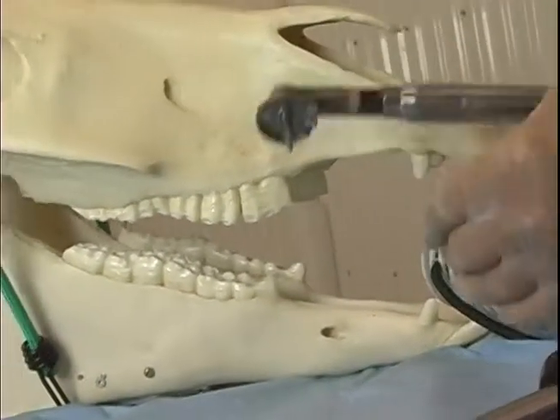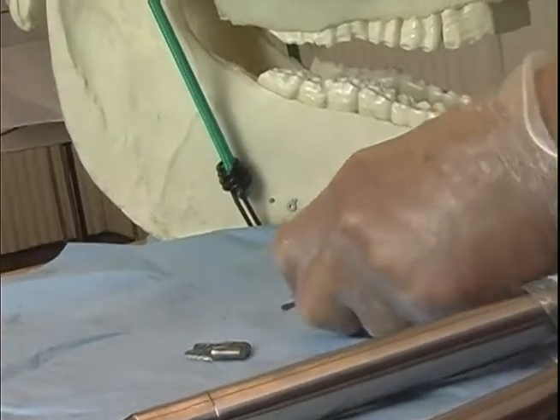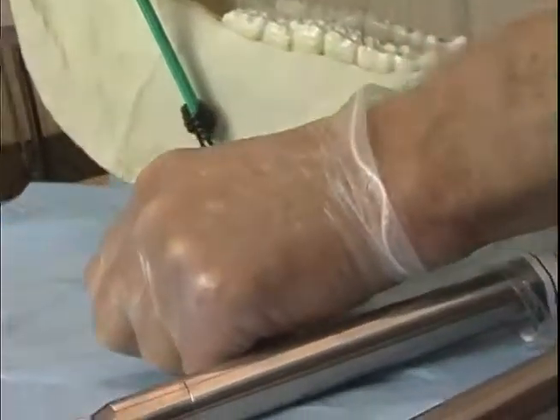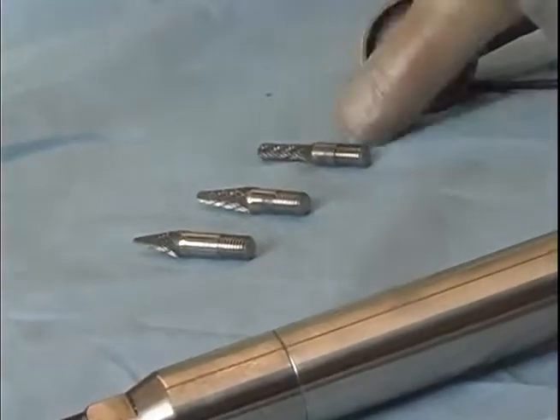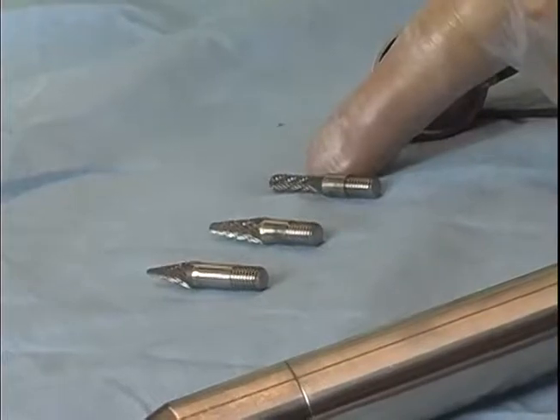Valve diastemas are very painful for the horse, and if we can widen the space between the teeth, we can eliminate the periodontal disease. So that is the narrowest. Some teeth are wider apart and require a wider burr. This last burr is 4.5 millimeters in diameter, and that would be the widest space ever needed.